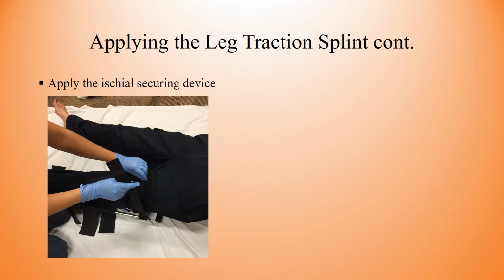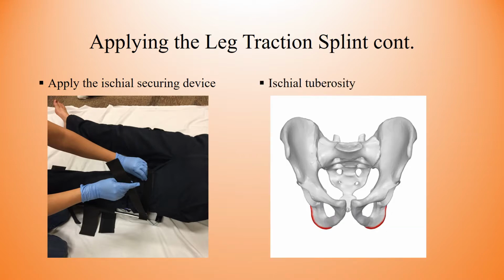Then you will apply the top strap, which is called the ischial securing device. And for reference, it is named after the ischial tuberosity. And there it is on both sides.